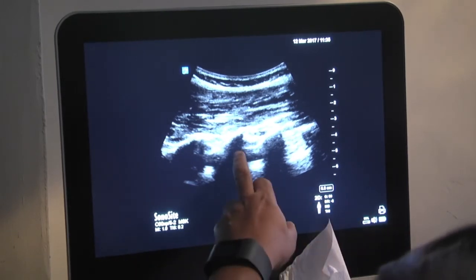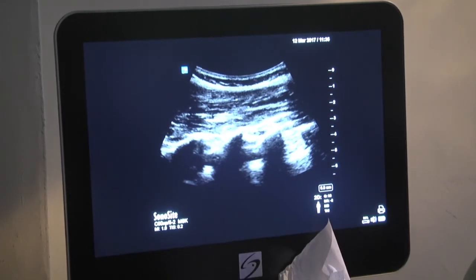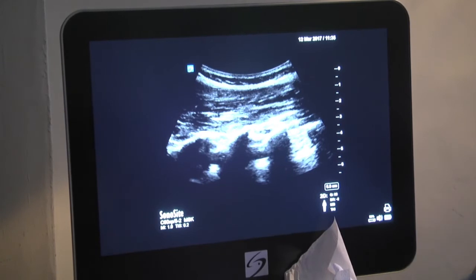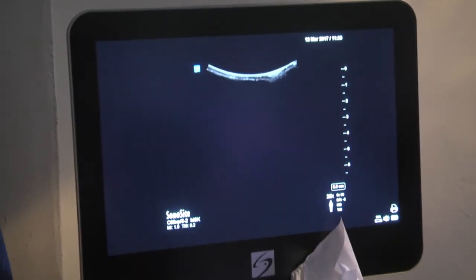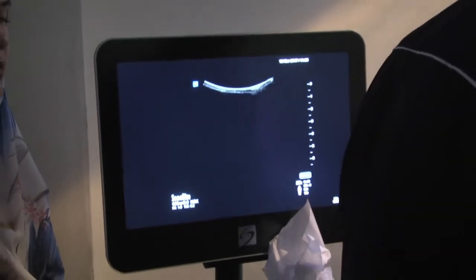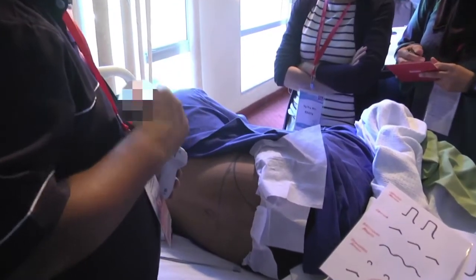Because if I know there is a gap between L4, L5, I can look for L4, L5, put the needle paramedian, and find my way. Because I know there is a hole. You can walk your way along the bone, and boom, you will be there. Okay, so that's how you can apply this. So this is by far how you can use spine imaging. Okay, now in real time you can insert it in real time, but it's something which should come later on in your learning process.